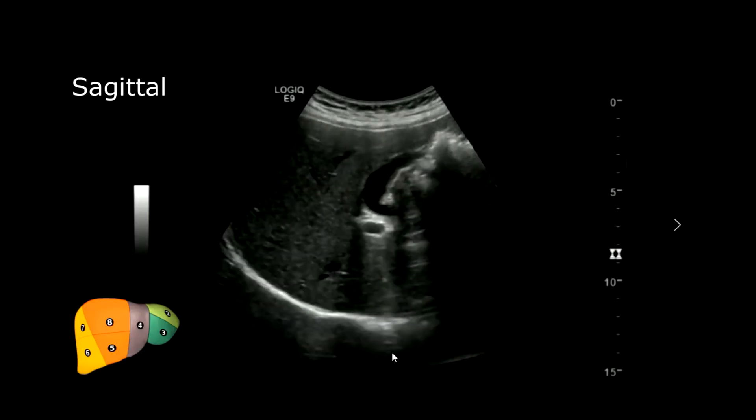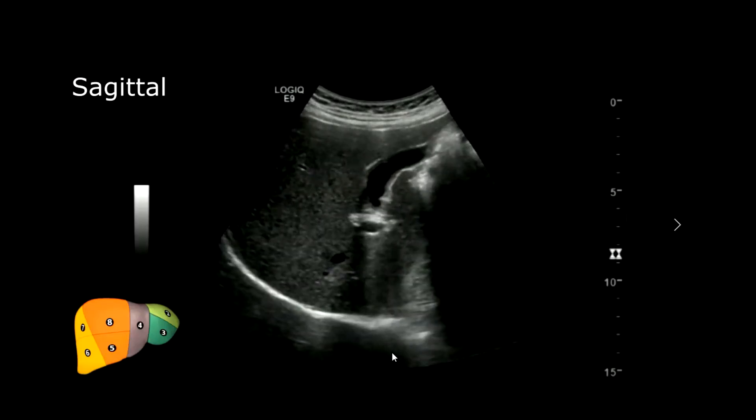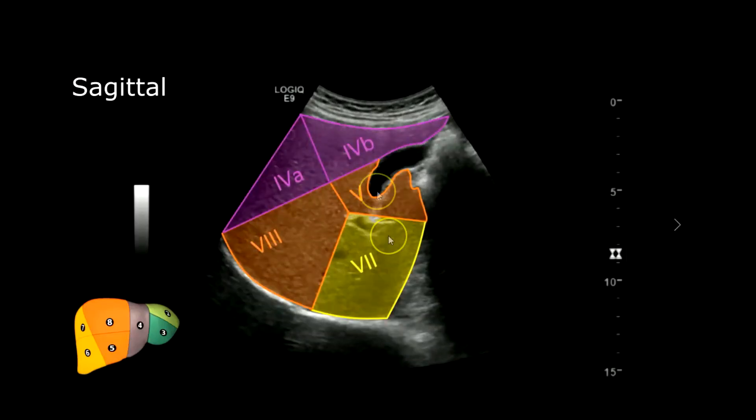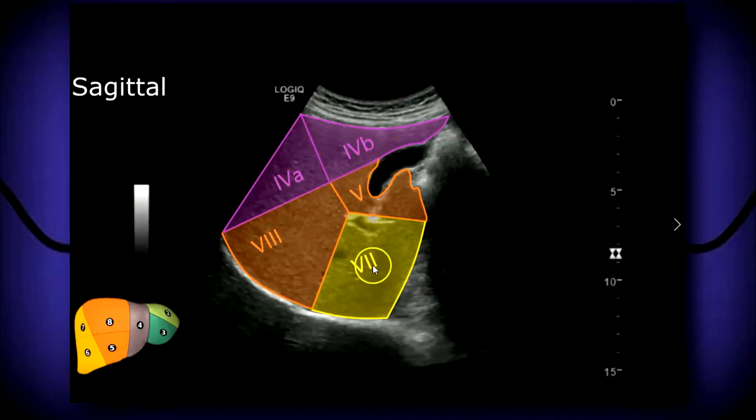Moving to segments 4, you can see a little bit of gallbladder right there. At the portal vein plane you can identify segments 4b, 5, 8, and 7.